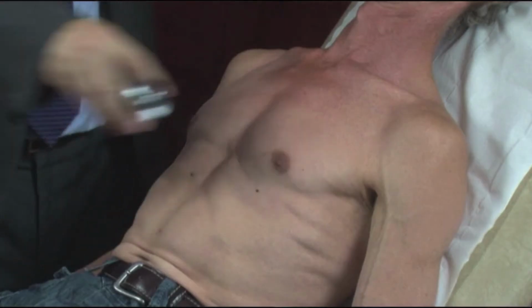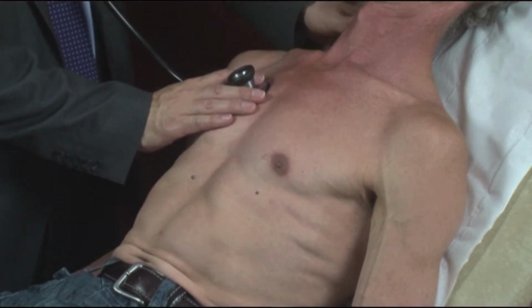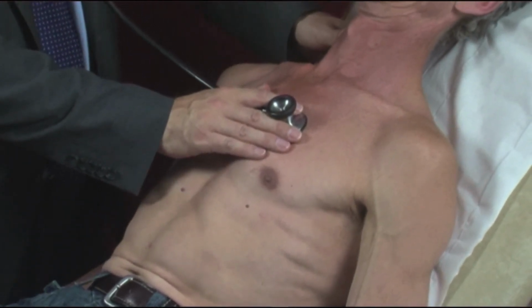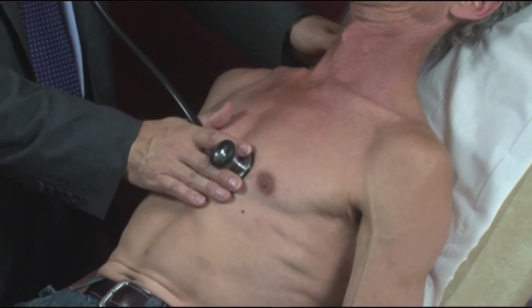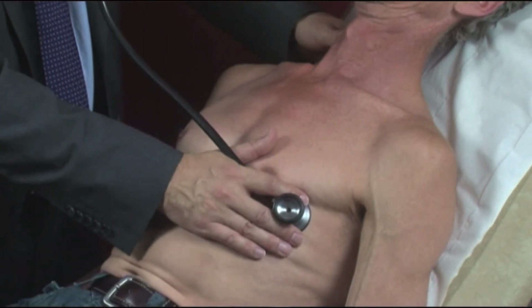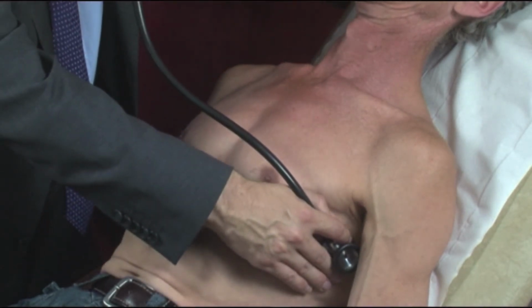The patient should be comfortable in the usual position as used for examination. Initially, auscultation should be performed in each of the four primary areas, that being aortic, pulmonary, tricuspid and mitral, and it's often wise, as you can see in the video, to time the sounds heard to the carotid pulse. Dependent upon the findings from these positions, modified locations may also be required.